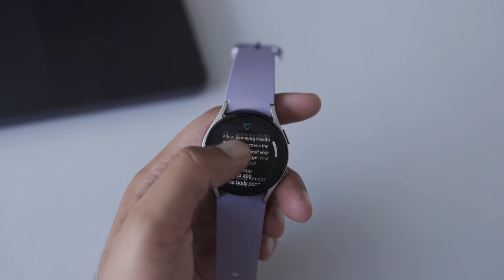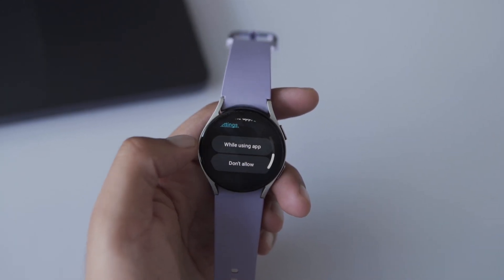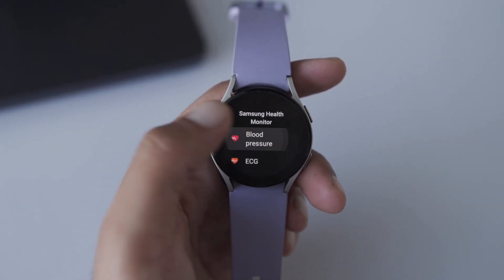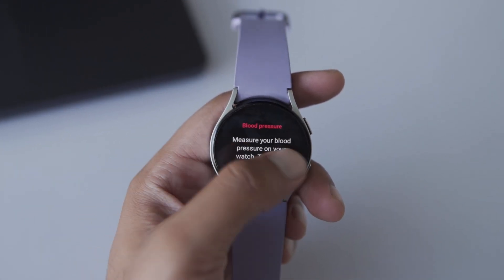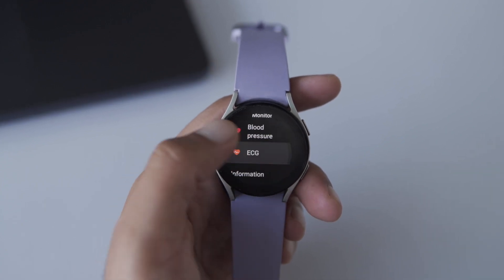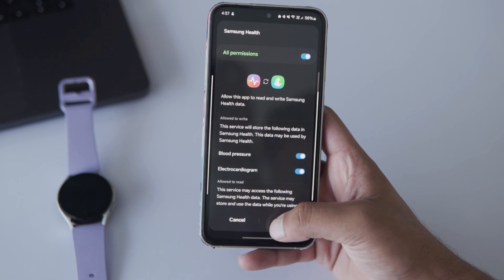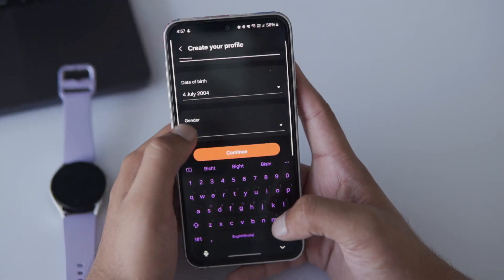I have already installed it, but after installing, make sure to fill in your basic details. Next, open the Samsung Health Monitor app on your Galaxy Watch. You'll see the ECG option right there — go ahead and tap on it. It'll ask you to follow a few instructions on your connected phone, so tap Open on Phone.